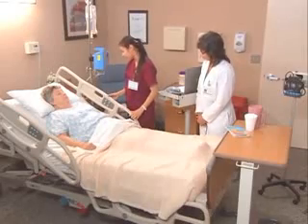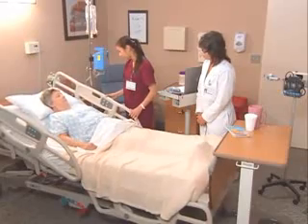Now, as I said, we need to check your blood pressure in several positions. So, I'm just going to lower the head of your bed. Will I have to lay here like this for long? 3 or 4 minutes. Are you okay? Yes, I'm okay. Have you had any caffeine in the last 30 minutes? No. And you haven't been physically active in the last 5 minutes or so?